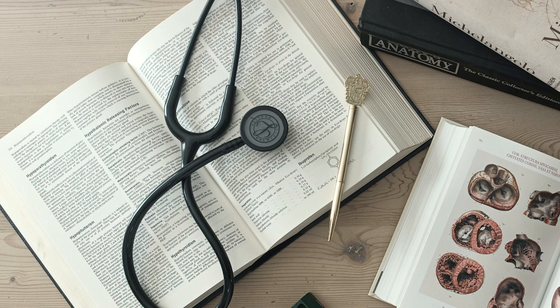Rule number 3. After assessing the P wave, you evaluate the PR interval. This interval, remember, reflects AV nodal conduction. So you're looking for prolonged PR intervals, whether they are regular or irregular. A consistent or progressive prolongation immediately indicates AV nodal pathology, which typically points to some form of heart block. It tells you if the AV bridge is intact and functioning properly. Okay, check the AV bridge with the PR interval.